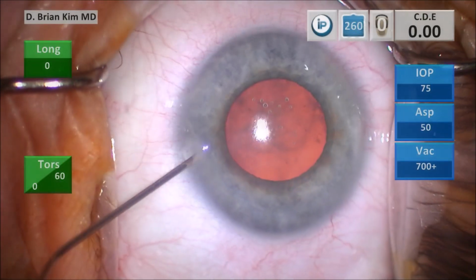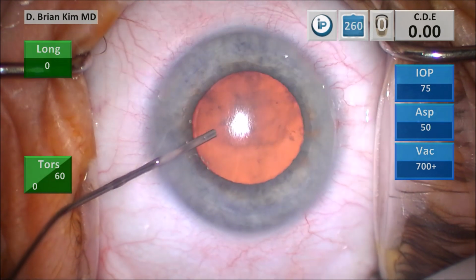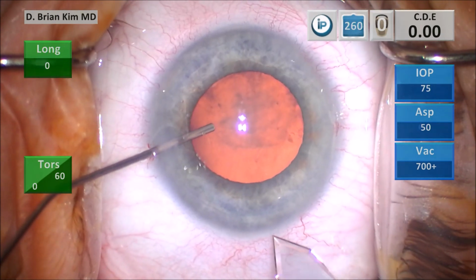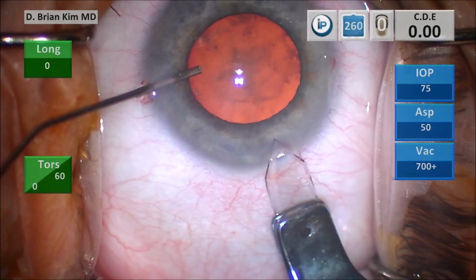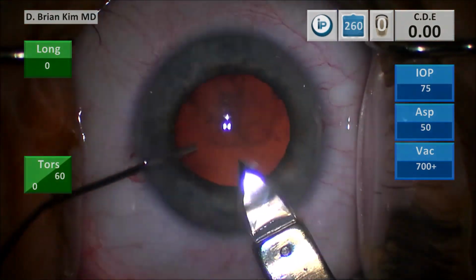I'm injecting some dispersive viscoelastic to fill the anterior chamber. And you can see I get some pretty good viscodilation, but otherwise the epinephrine didn't seem to help enlarge the pupil. Perhaps it stabilized it. I'm doing my triplanar corneal incision. I'm making a vertical groove, placing the blade into the groove, tunneling through the cornea, and entering the anterior chamber.